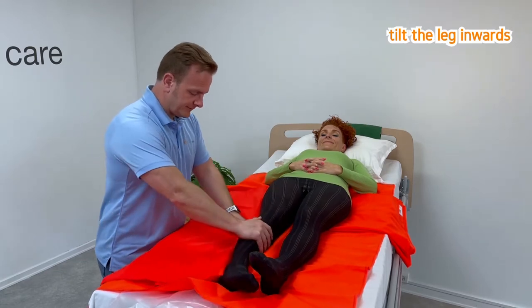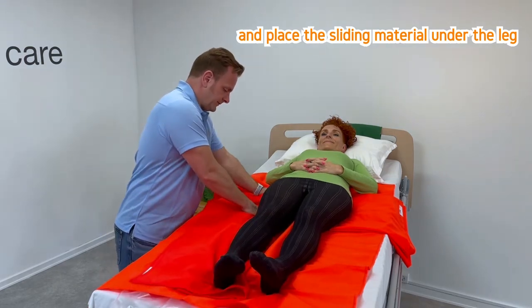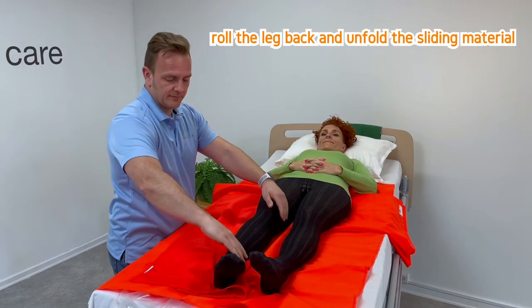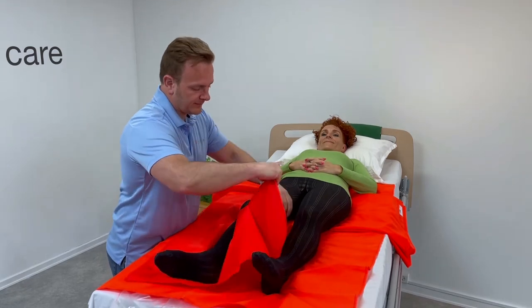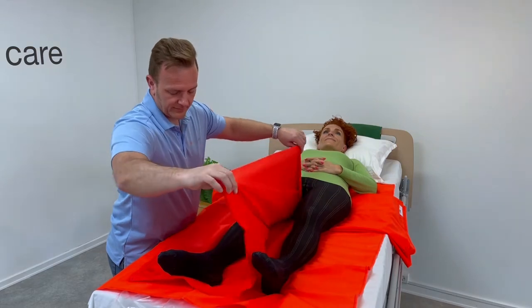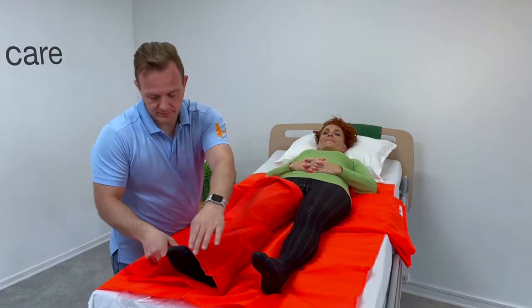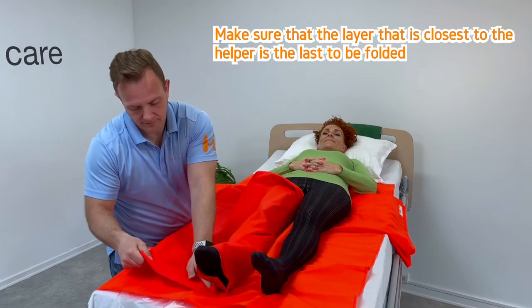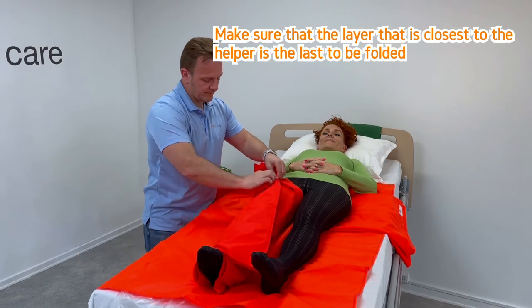Tilt the leg inwards and place the sliding material under the leg. Roll the leg back and unfold the sliding material. Finish wrapping the leg. Make sure that the layer closest to the helper is the last to be folded.